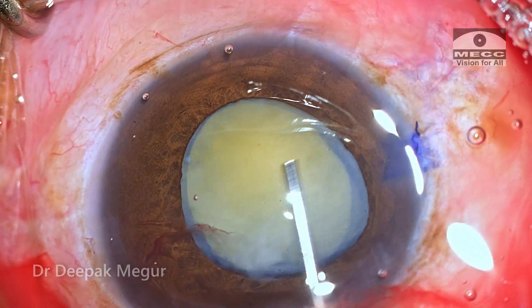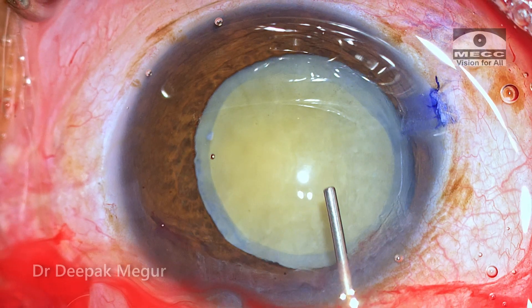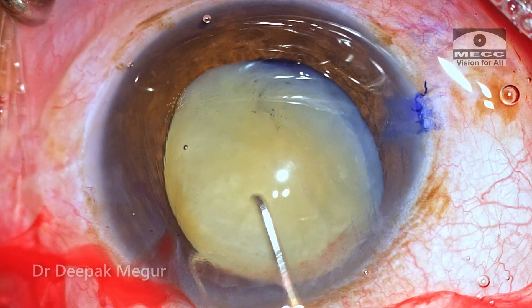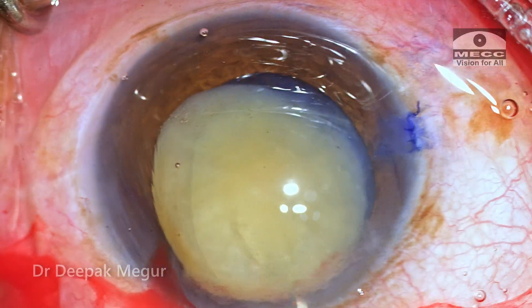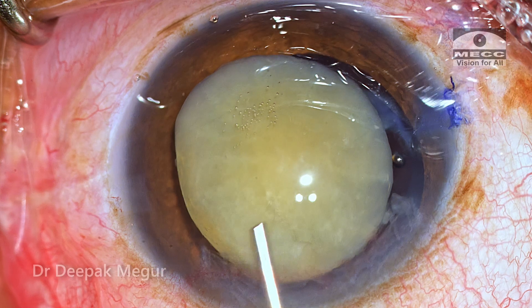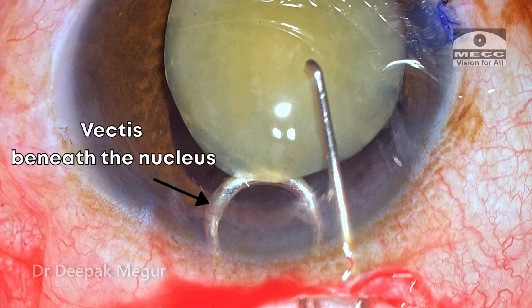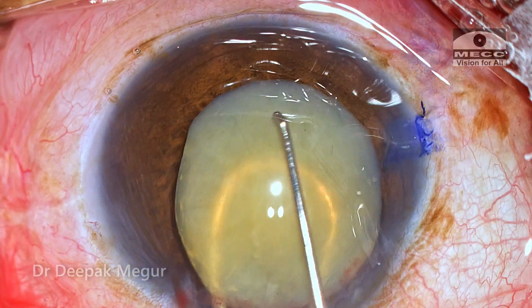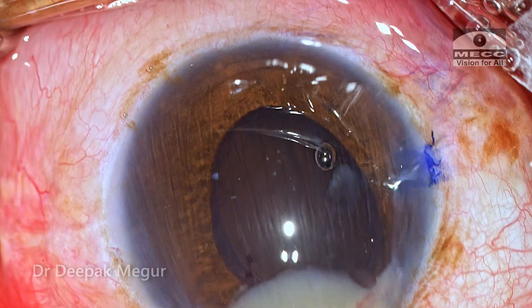Time to express the nucleus. The chamber is again deepened with OVD. Using two Sinski hooks, the nucleus is gently manipulated out of the capsular bag, and then using the phaco sandwich technique, I introduce the vectis beneath the nucleus and the Sinski hook above it. The nucleus is grasped between these two instruments and gently pulled out of the anterior chamber.